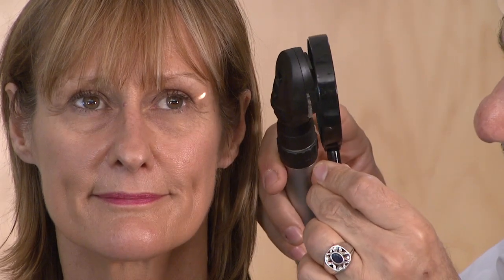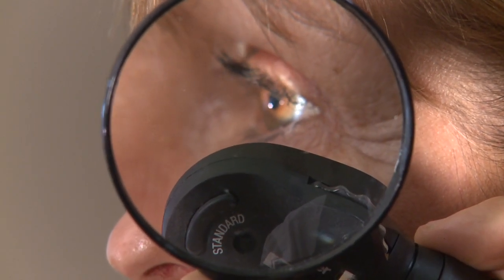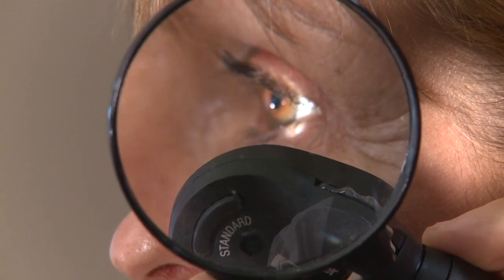The one thing most GPs can't easily do is examine the anterior chamber — you need a small magnifier like this. Open your eye wide, and use a tiny beam of light which you can adjust on your ophthalmoscope. You can then see the dome of the cornea and the iris behind it. Her anterior chamber is quite deep, but if the cornea and iris are in contact with each other, that indicates a shallow anterior chamber and possibly acute glaucoma — which she doesn't have.